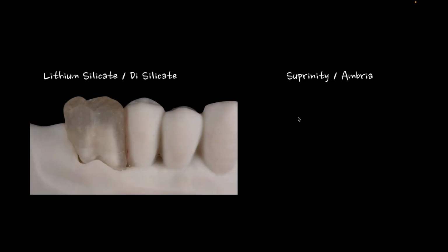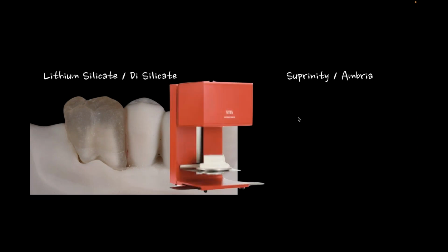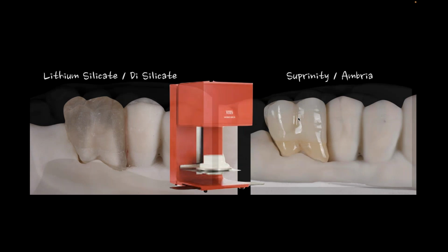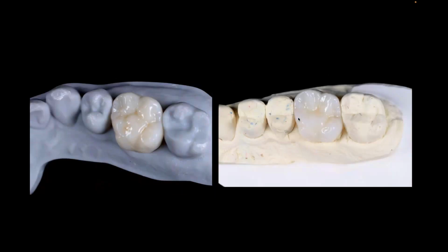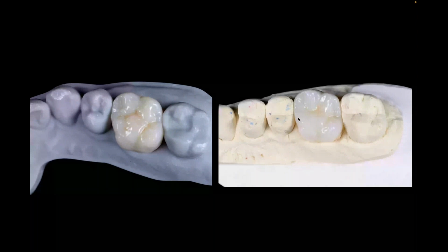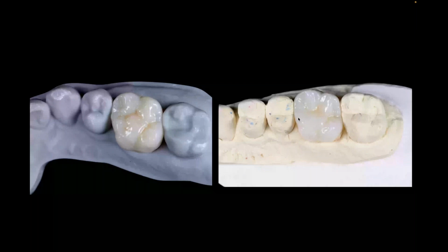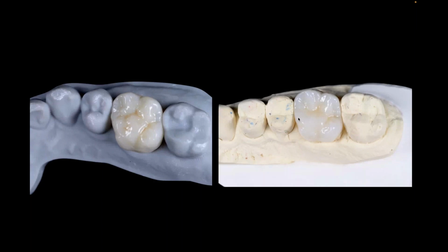So no matter what your method of getting there, whether it's lithium silicate or disilicate, if you're milling straight from the product or you're waxing and pressing, that understanding is almost secondary to all the other important attributes that come into play. And can I make lithium silicates and disilicates look a little better? Yeah. Most of you probably know there's a slight difference between silicate and disilicates. But the truth is, can I make them look as good as a hand layered crown? The answer is probably no. I think I can get closer today because the materials are getting better and better.